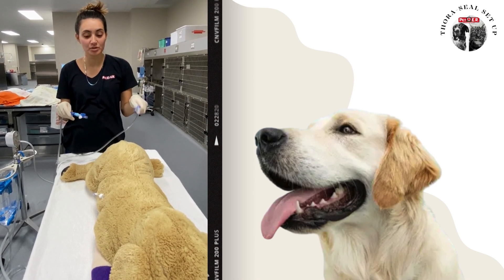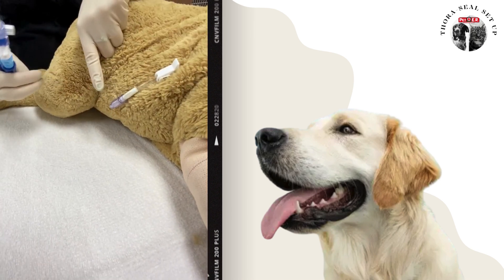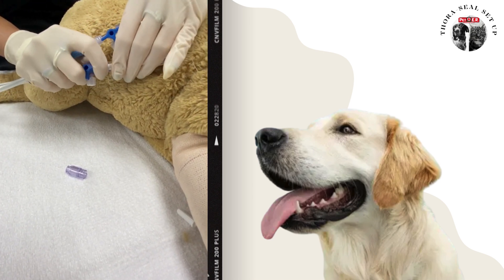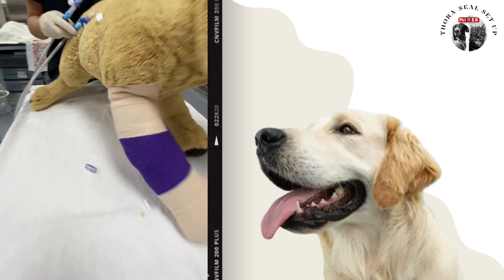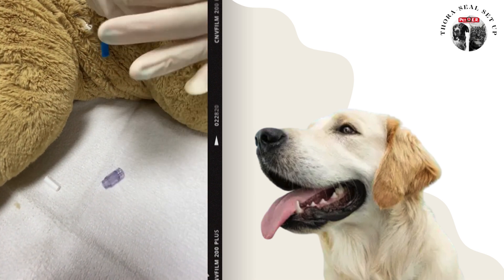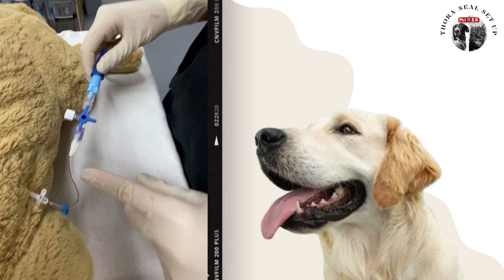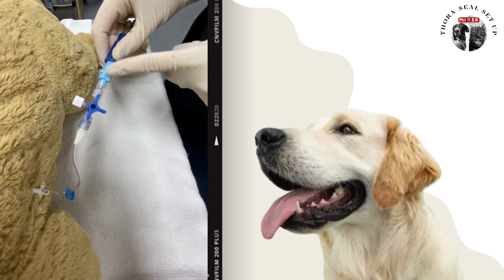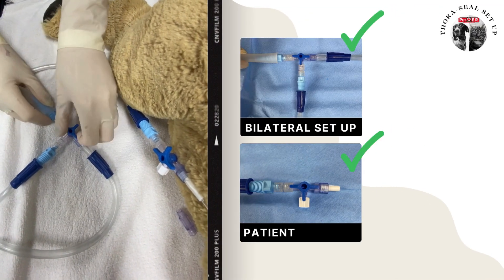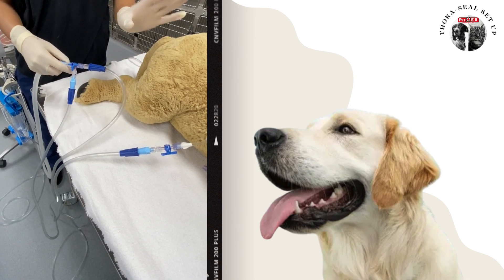Now you're going to take your two ends that are going to hook directly up to your patient's chest tubes — these are the Mila ones. Your doctor is going to have this clamped and put a cap on it. Take your cap off and hook up your stopcock directly to the patient. Go to the other side — same exact thing — this should be clamped; take off your cap and put the end of your stopcock on here. Make sure all openings are correct: it needs to be in a straight line, open to the patient and open to suction and off to the world. Turn it so there's suction to all ports, and put wire around all your ports so that this patient never gets unhooked.